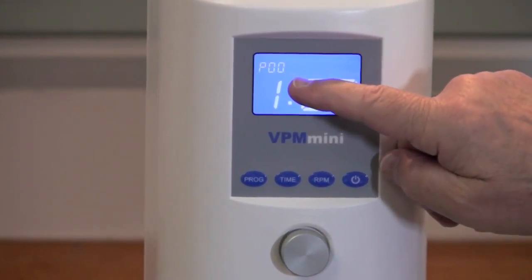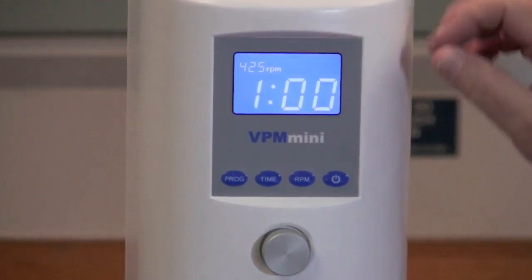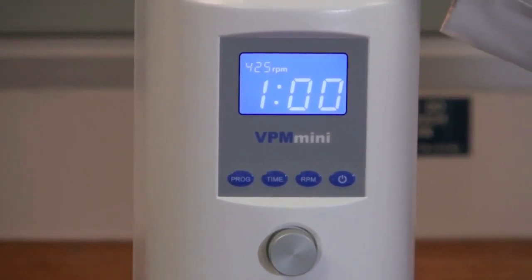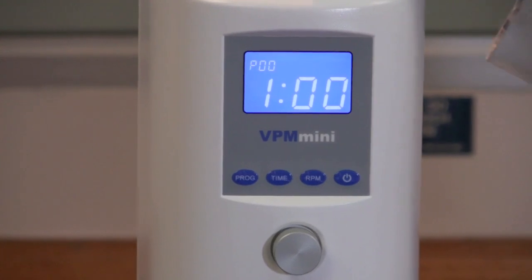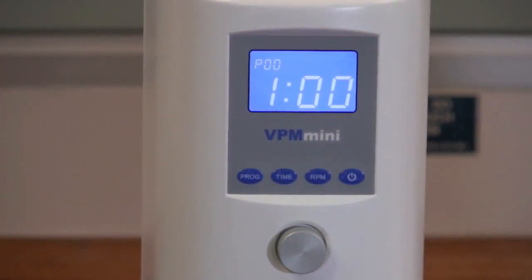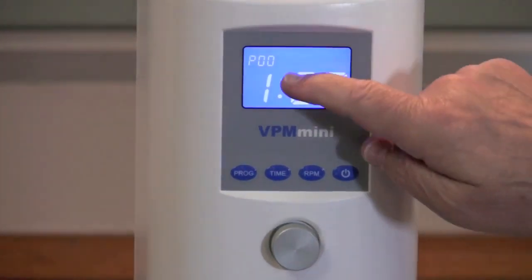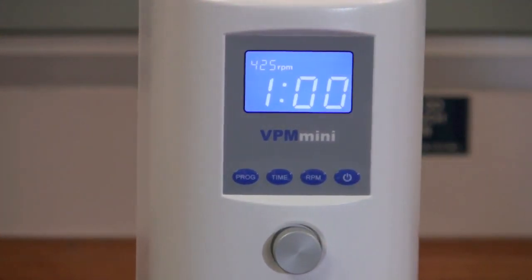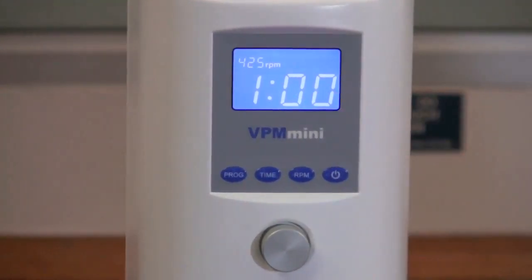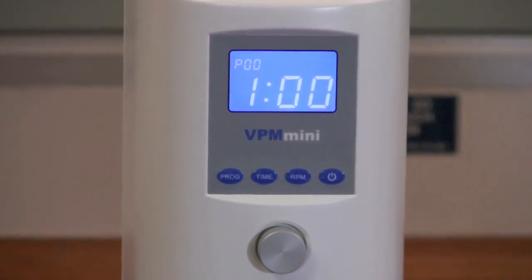Up here in the left-hand corner you're going to see something flashing. It's telling you first, where it says P00, that you're on program 00 and that the speed of rotation of the paddles for this particular program is 425 RPM. It's also going to mix for one minute, which is shown on your screen.